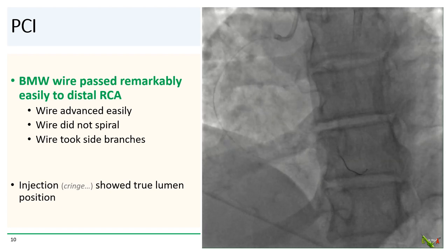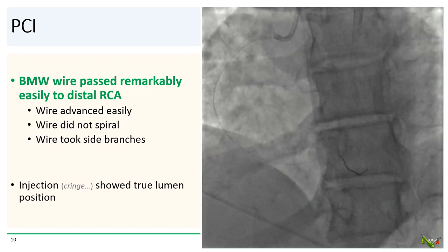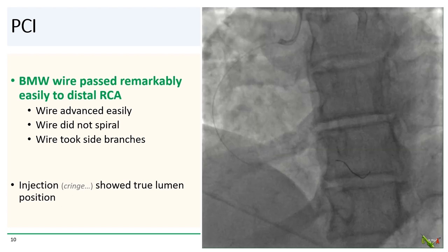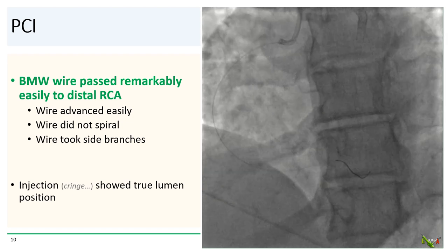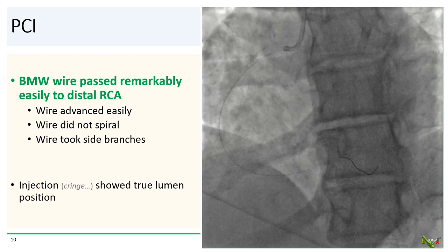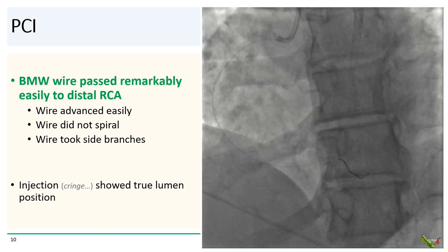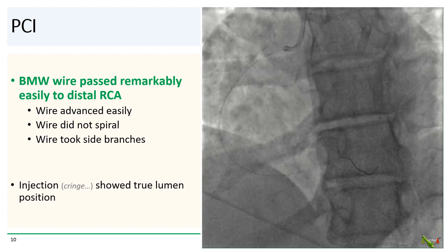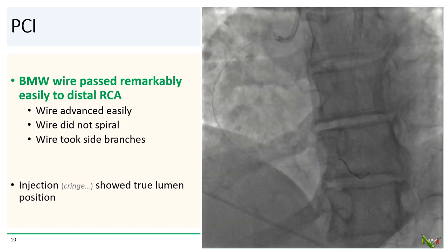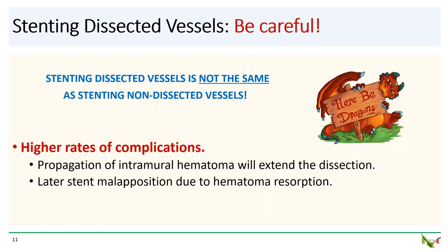Back to our patient. Miraculously, a BMW wire passed fairly easily to the distal RCA. The wire advanced easily, did not spiral, and took side branches very easily. Although there were no collaterals for contralateral injections, we were fairly certain that we were in the true lumen. As we discussed, contrast injection should be avoided as much as possible, but we thought it was necessary here to confirm our wire position. The injection confirmed our wire was indeed in the true lumen.